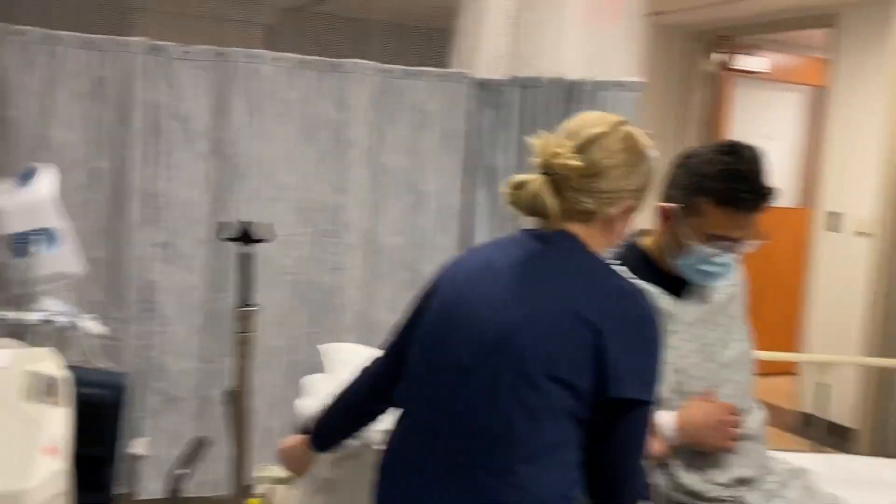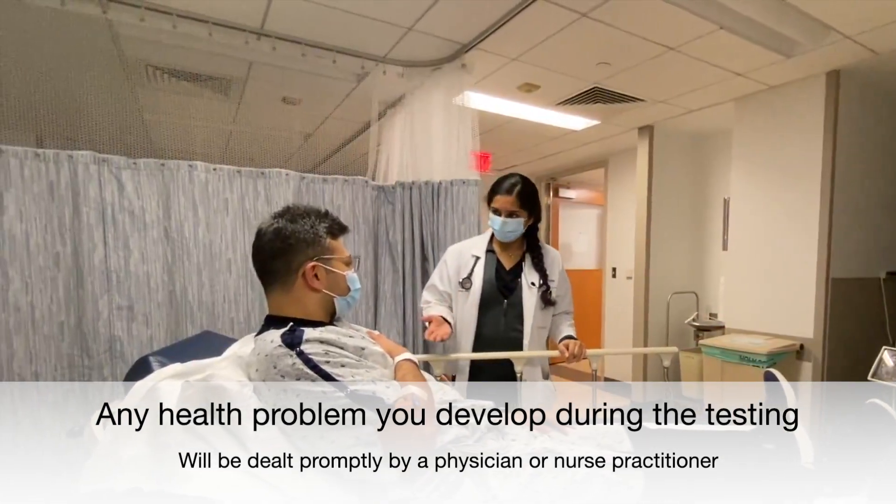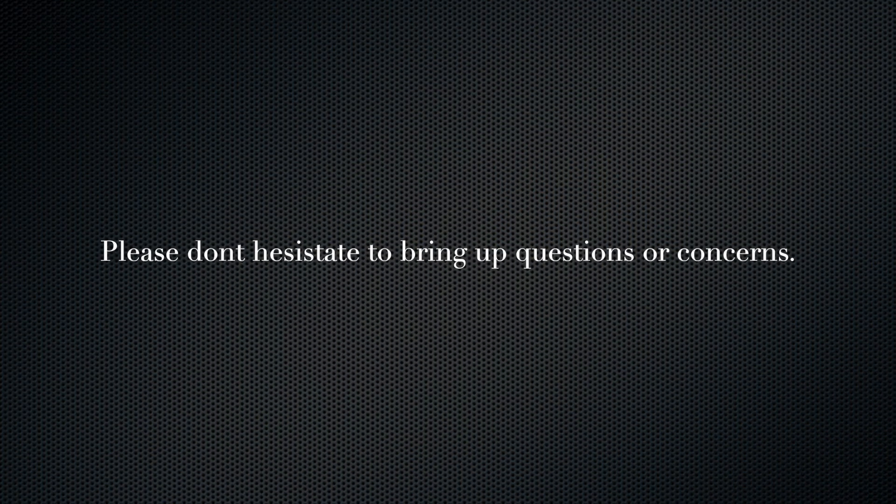The test can cause a heart attack. Although this is unlikely to happen, it's still a risk. Should anything occur, we have staff and medications to treat you. If you have any further questions, please don't hesitate to ask the nurses or the physicians in the stress lab.